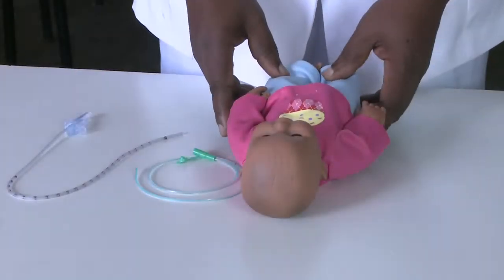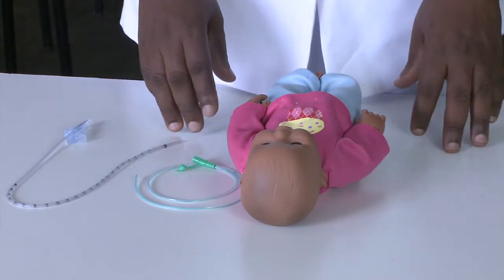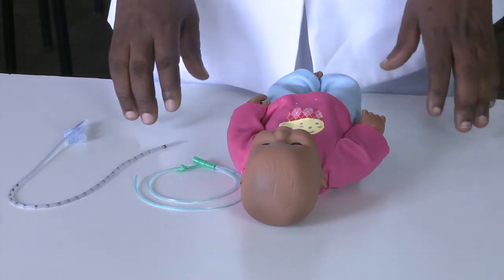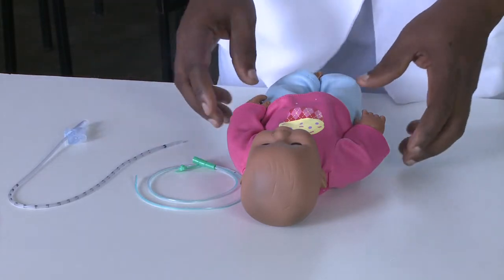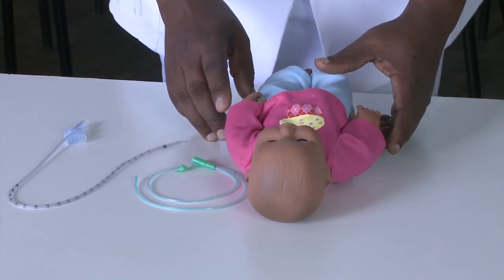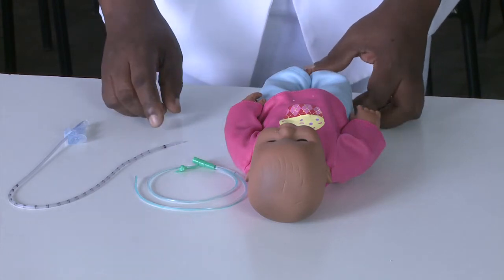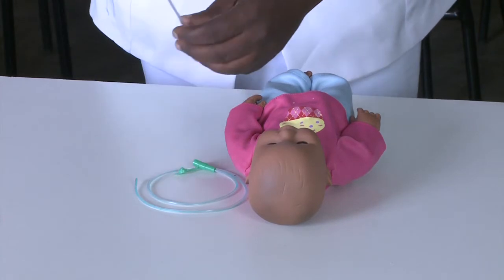So I have my patient here. This is a premature baby in the neonatal ward who is having respiratory distress. I'm going to put in an OGT for feeding because the baby can't take anything orally. Before putting in the tube, the baby is having some secretion in the nostril and in the mouth. So I'll try to suction first, then insert an OGT. So I have my suction tube here.